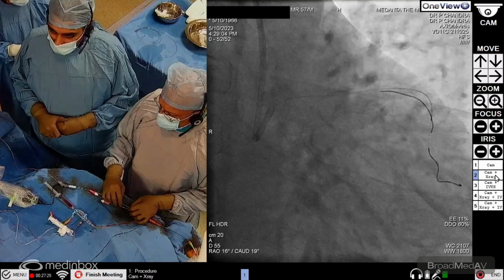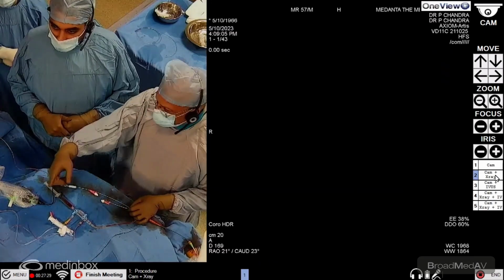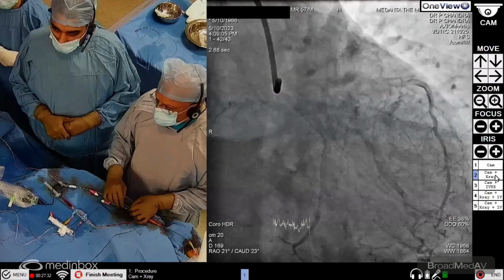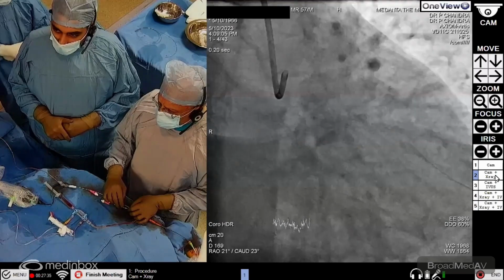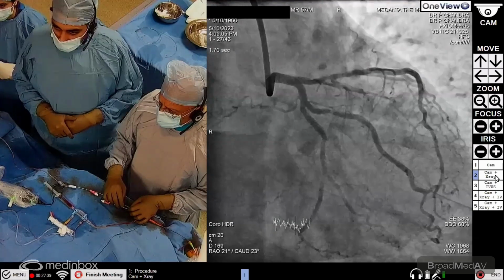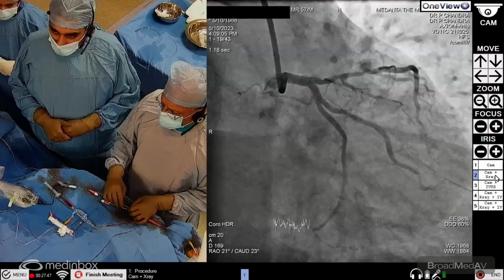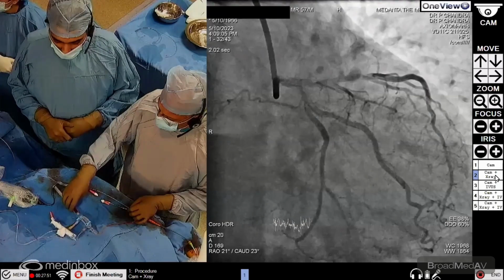So angiography was done, which showed a critical, moderate stenosis of the LAD, proximal to mid. Mostly it is calcified and it is 80 to 90%. So our plan was to fix it with a cutting balloon and IVL, followed by a drug-eluting balloon, because his platelets are low. So we don't want to keep him on dual antiplatelets.